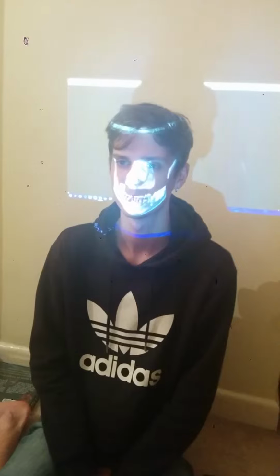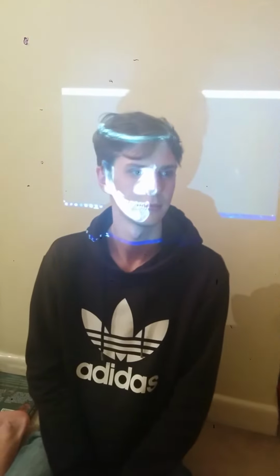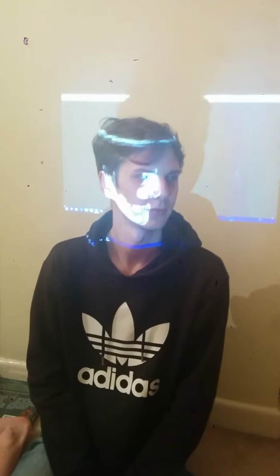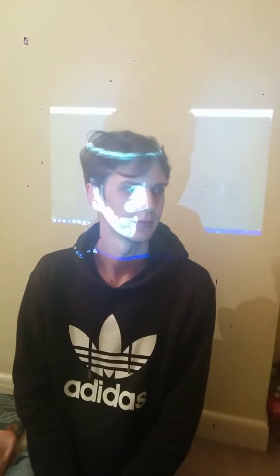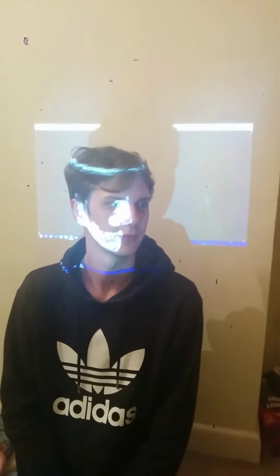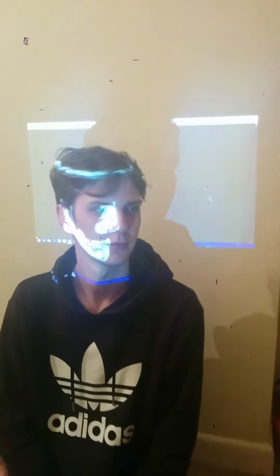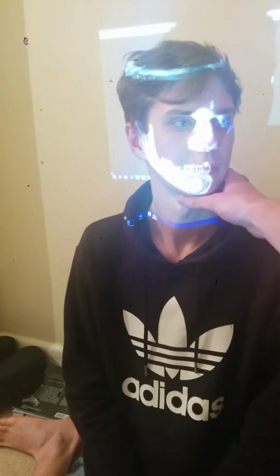If the patient then turns his head slowly to the left, you can see that the STL file is in fact rotating with the patient's face. However, due to the difference in the axis of rotation, the picture is not perfectly displayed on the patient's body. This will require a minor alteration by the doctor or technical expert, just to move the patient back in line with the image.